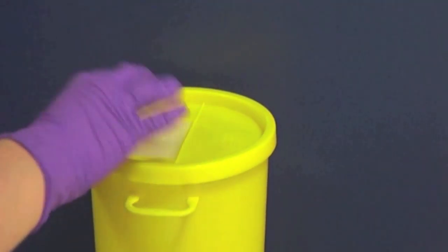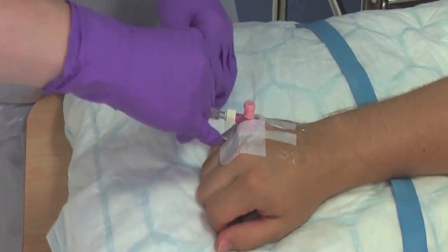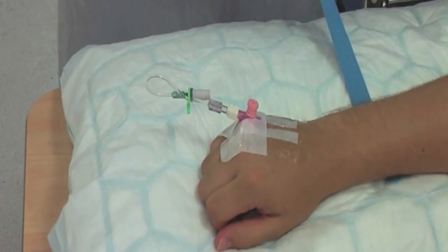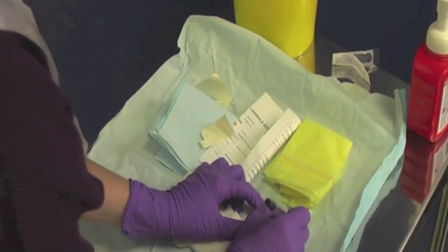Clamp the bionector and dispose of the tourniquet. Ensure that you document the date of insertion using the sticker provided on the dressing and place next to the cannula site.